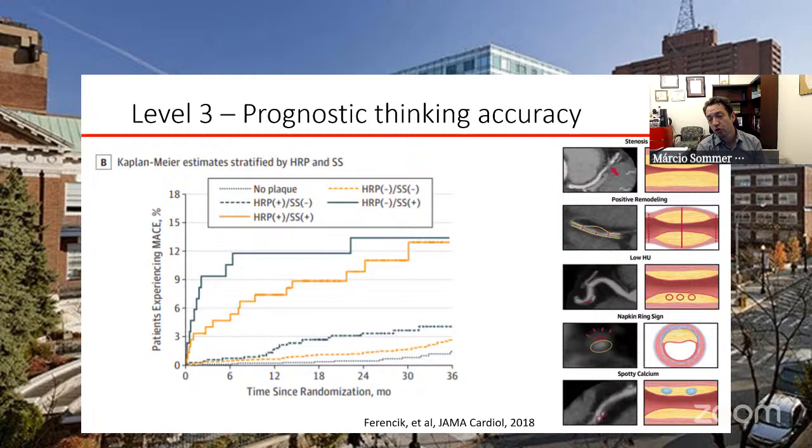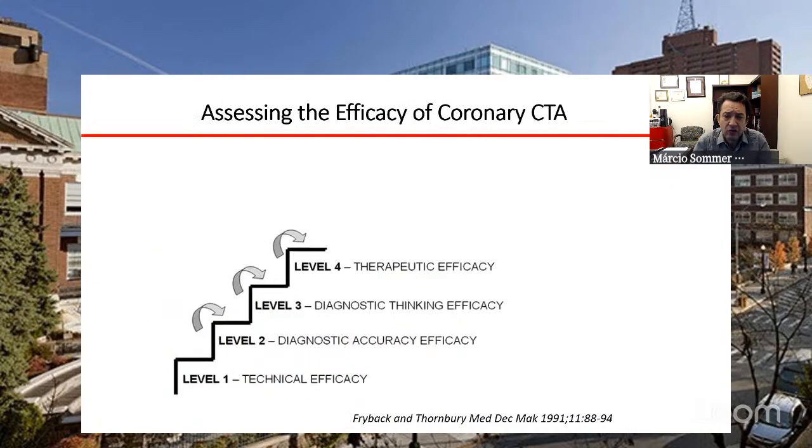So it is: do we have plaque, how much plaque, how obstructive the plaque is, and how the plaque looks, that collectively give you CT information on prognosis. So I think there's enough data to say presence, extent, severity of the obstruction, and plaque characteristics all support the idea that CT has very good diagnostic and prognostic information for us to diagnose obstructive coronary artery disease in stable chronic patients, as that's the case of all these patients.